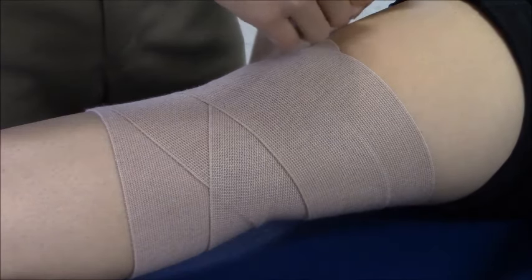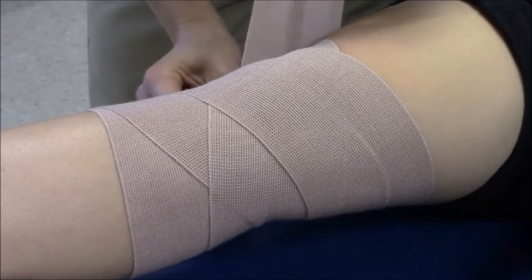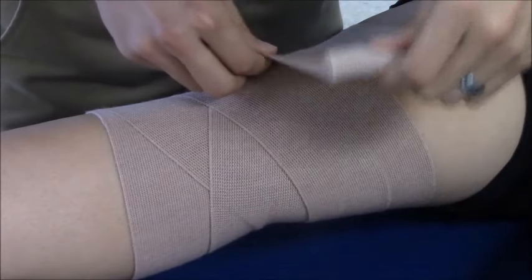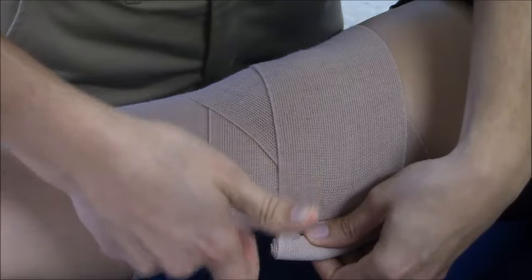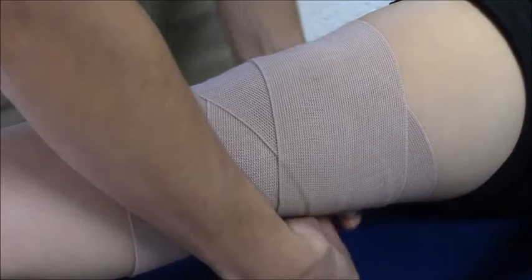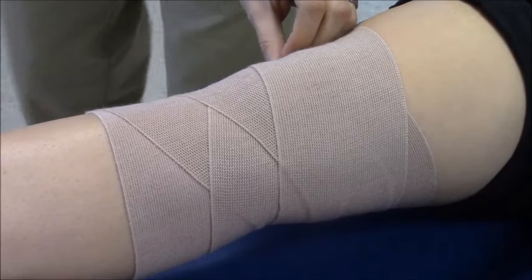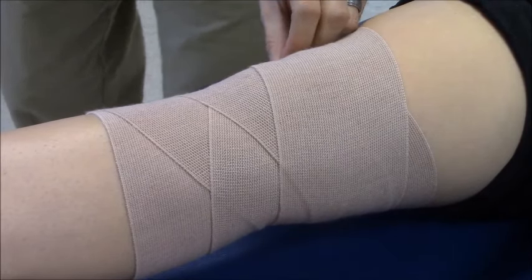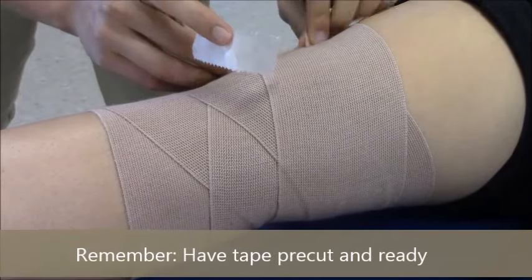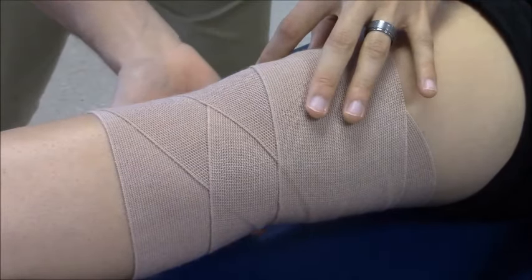So basically it's a series of alternating directions, and as you can see, each successive wrap is parallel to the one after it — these two are parallel, these two are parallel. Then I'll just secure it with a piece of tape, making sure there are no windows.